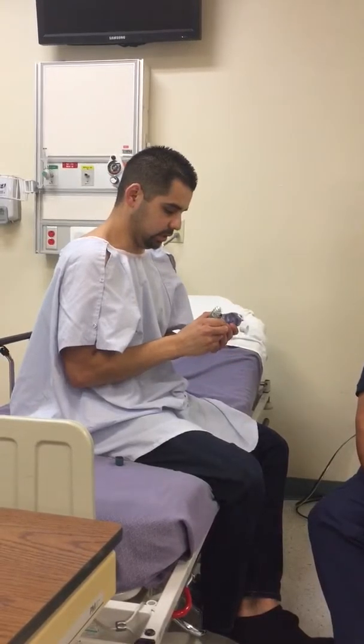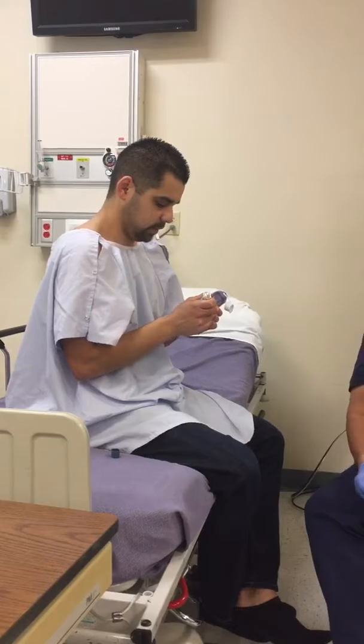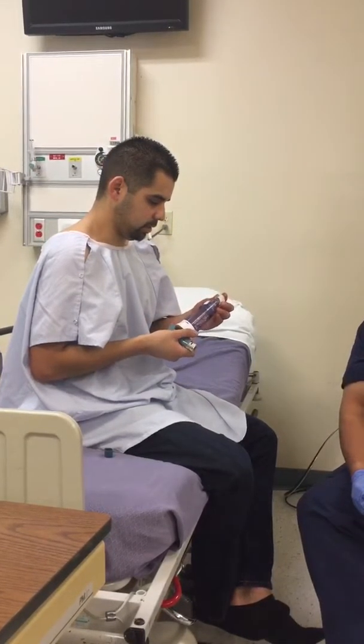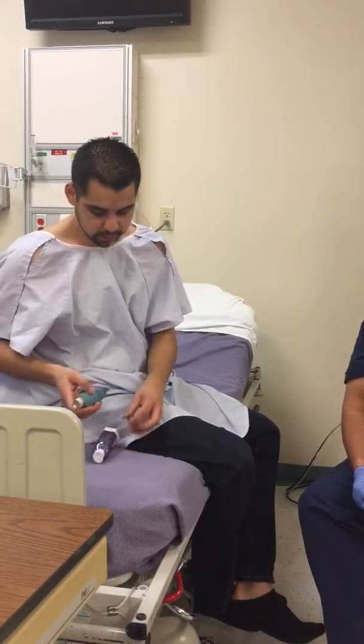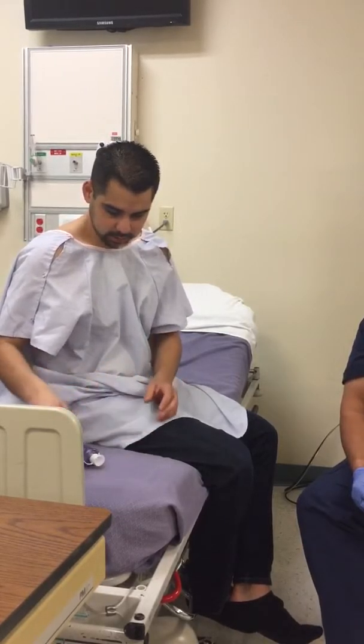Okay. And then just pull that off. Take this off, exactly, and then put the cap back on. Right. And put the mouthpiece back on to keep it clean for storage. Okay, all right, good job.